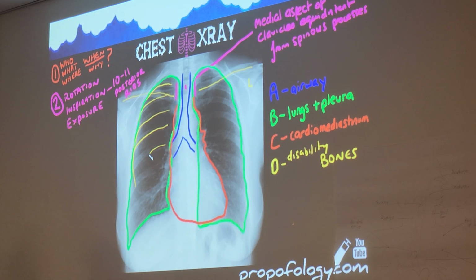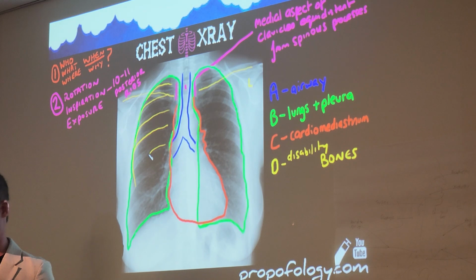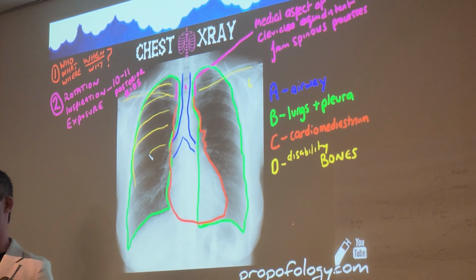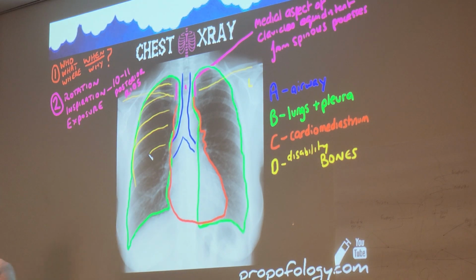And how do we acquire the 10 ribs? What's the breathing technique? I want y'all to see the whole process though, guys, just to solidify. Take a big deep breath in, blow it all the way out. Another big deep breath in and hold it. And that will fully inflate the lungs with the hopes of getting those 10 ribs shown in the lungs.